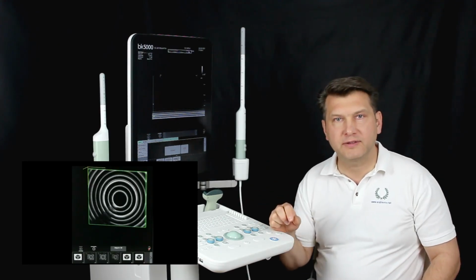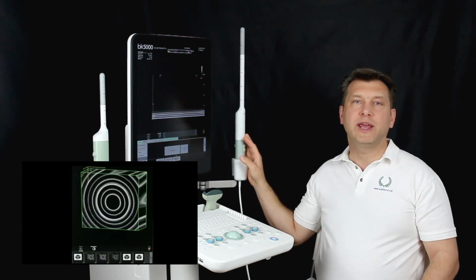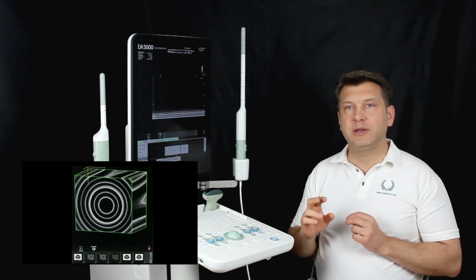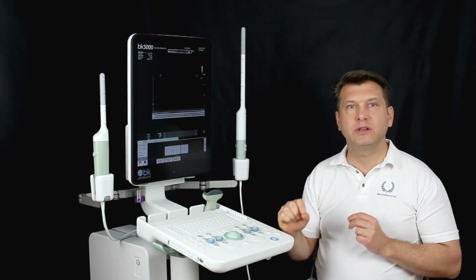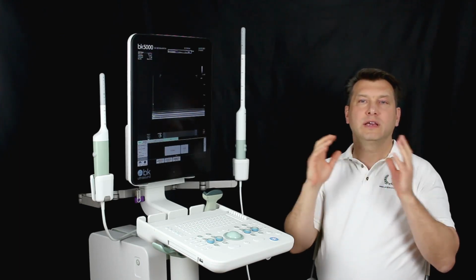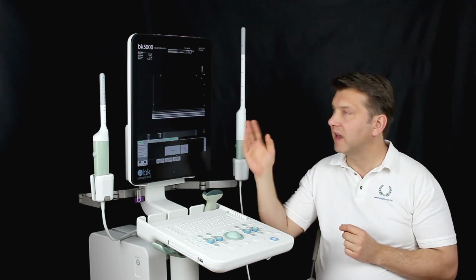And the recording starts. Now it is time to keep the probe calm and wait. After the recording, a 3D box appears in the picture. Here it is important to note that this box is always the same size, regardless of whether the examined structure was 1 cm or 10 cm in size.